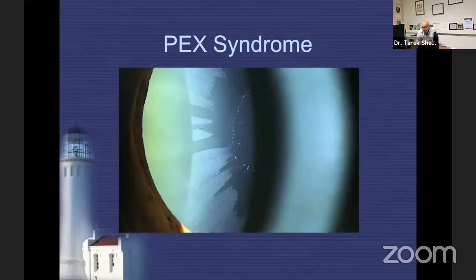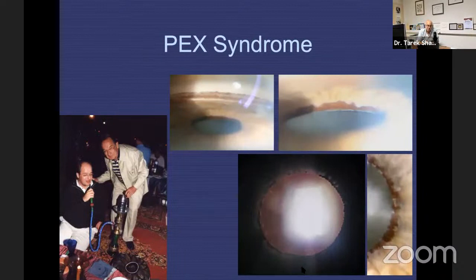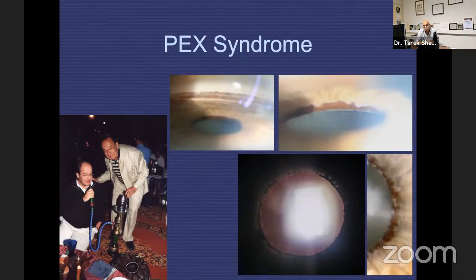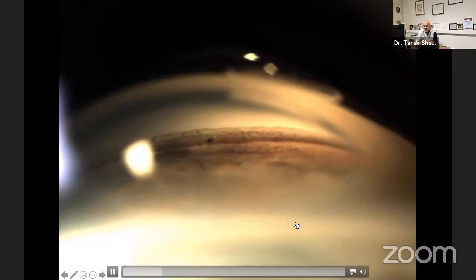Pseudoexfoliation syndrome is a very important part of practice — it is the most identifiable cause of secondary glaucoma. Gonioscopy is of paramount importance in PEX, especially after lens removal. This is the famous Sampaolesi line, named after Roberto Sampaolesi, a very good friend and mentor whom I lost a couple of years ago. I really miss his wisdom.